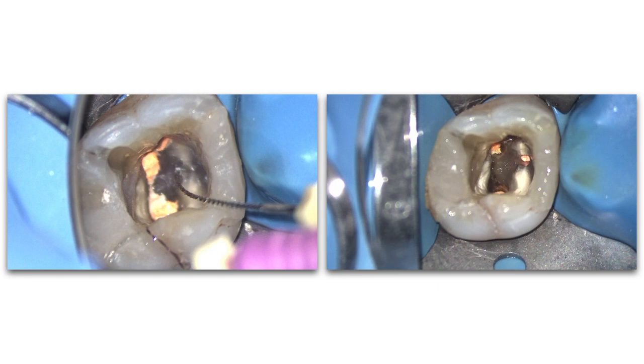I know that there are other rules to show you the site of the MB2. For example, we can make a line from MB to palatal, then from the DB to this line, imagine, and the dentin map. Many ways, because you see here the dentin map is clear. Here the extension means that there is an MB2. All these are true, but the main issue is that with magnification we can see more.